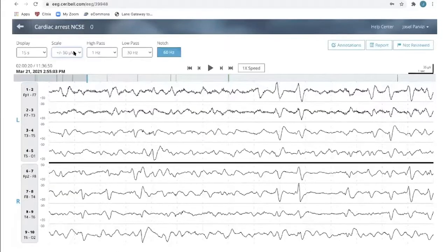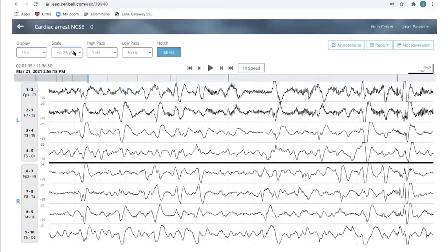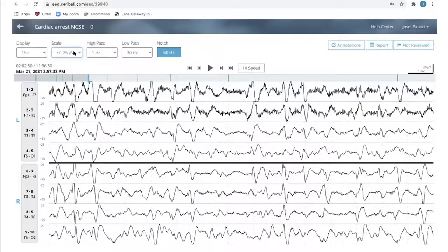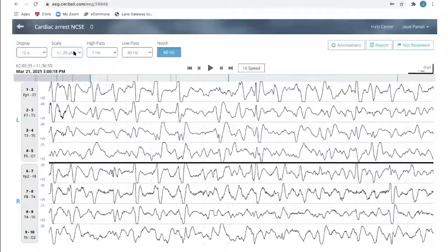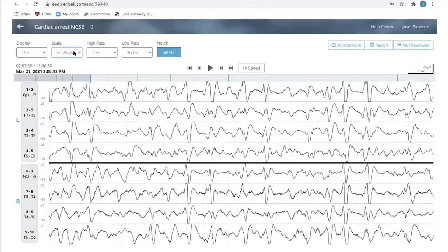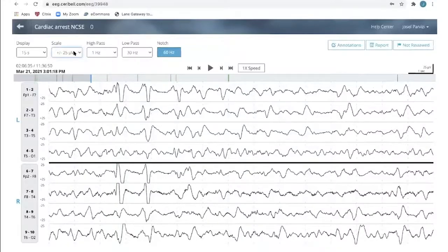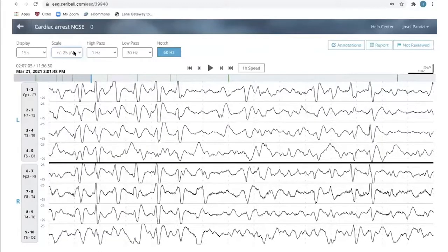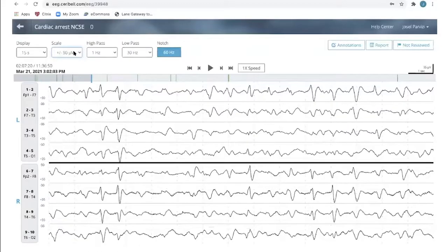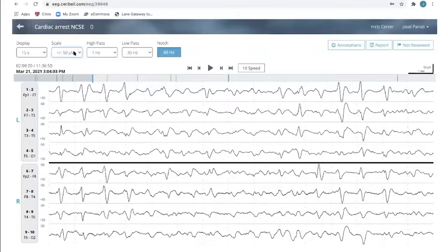I hate that we can't see the Clarity software here because it really provides a lot of visual information about how these build. Right. And that's one of the things for me about subclinical status epilepticus, how, like you were talking about earlier, it evolves. It's not like a clinical diagnosis of epilepsy where we just look at the pre-ictal, ictal, post-ictal phases and use the chronology and symptoms to make a diagnosis. Here we're purely using EEG because the patient is essentially comatose with no physical manifestation of any of this, no ventilator changes, no heart rate changes, nothing.